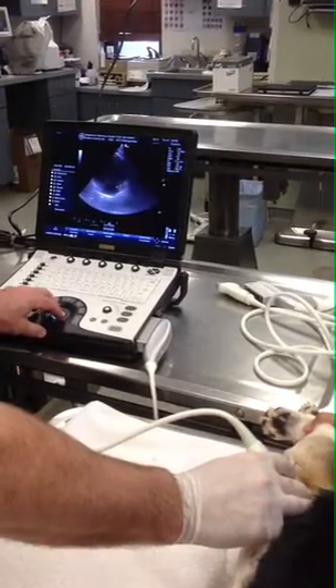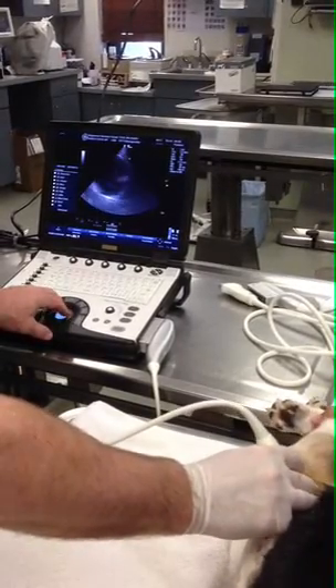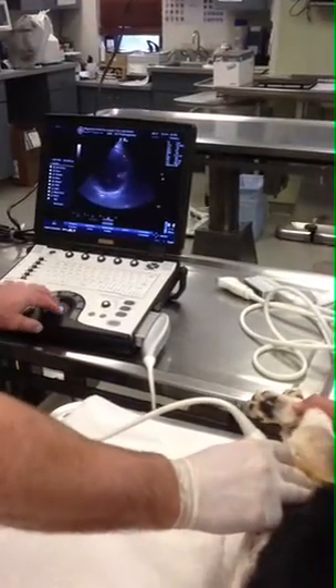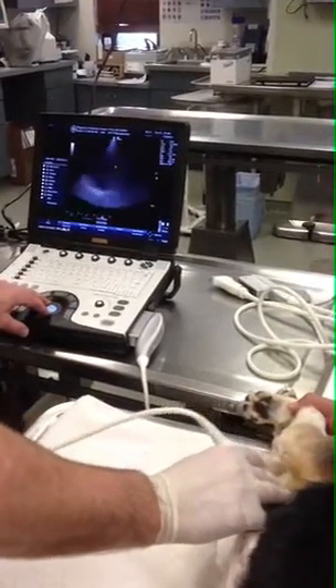You'd be pointing right towards the right auricle. And this is where I actually tap the pericardium from this view. I point towards the right auricle because that's where the last amount of blood is going to be pooling.